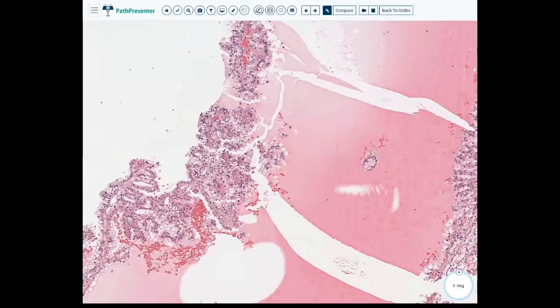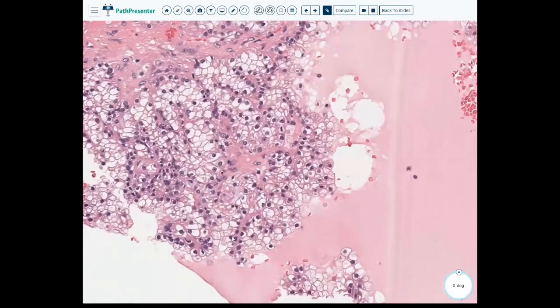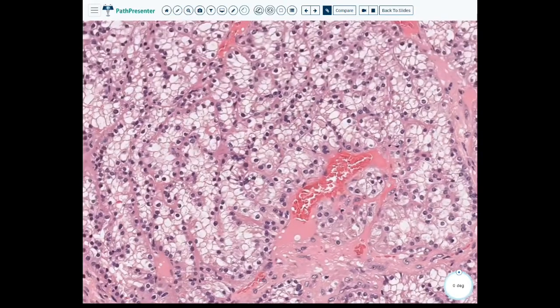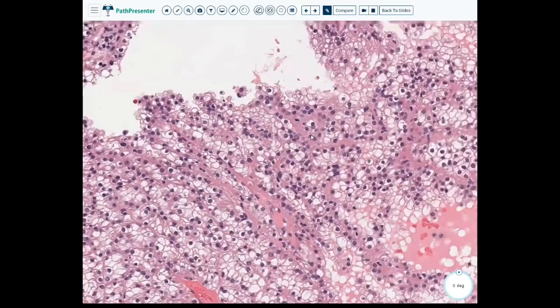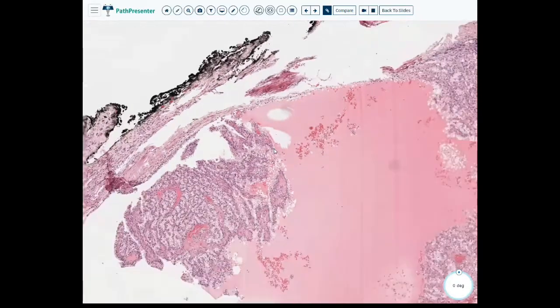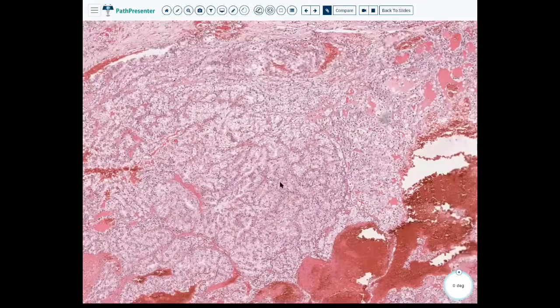But this is not a clear cell papillary renal cell carcinoma, because if we look, we don't have liftoff, okay? Here is our fibrovascular core, and our nuclei are at the base. So this all falls within clear cell renal cell carcinoma with papillary architecture, okay? These can be very confusing, but if you just remember the overall features, where the nuclei are supposed to be, and having the areas that look like more conventional clear cell up here, they really help you.